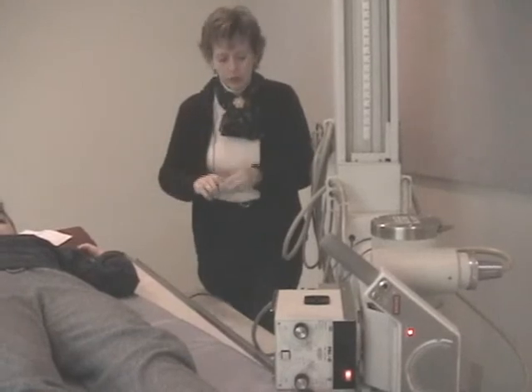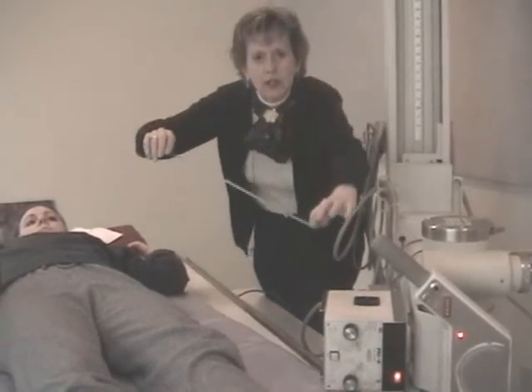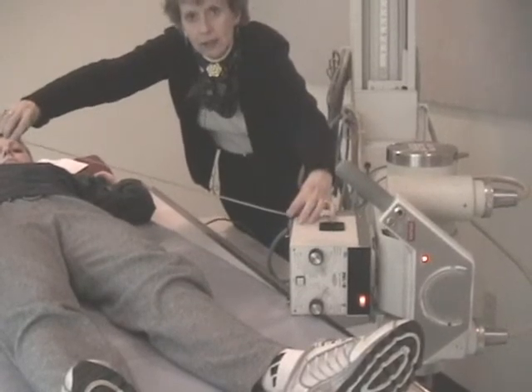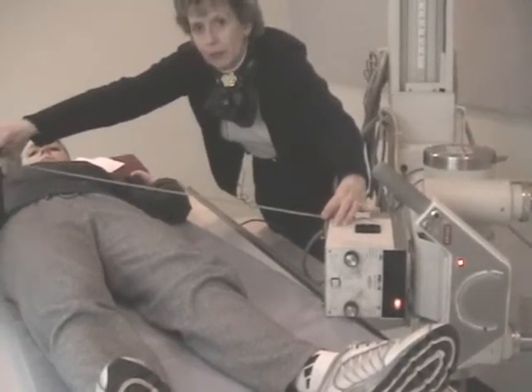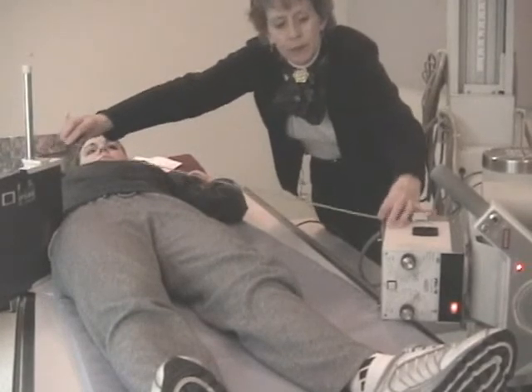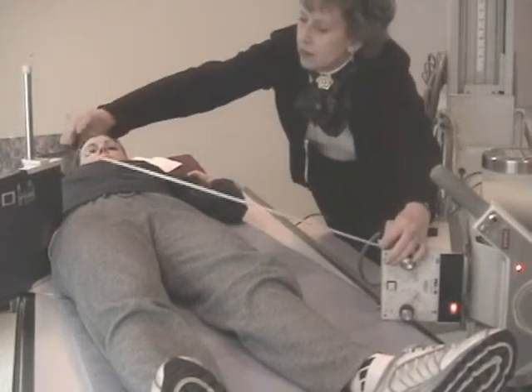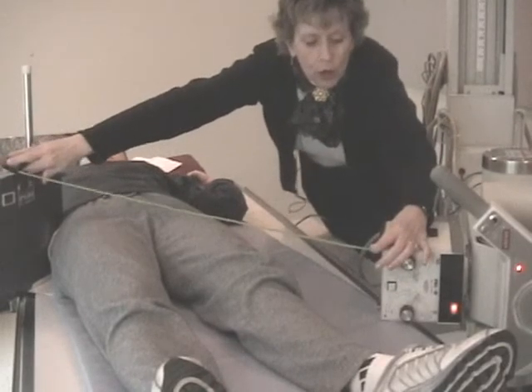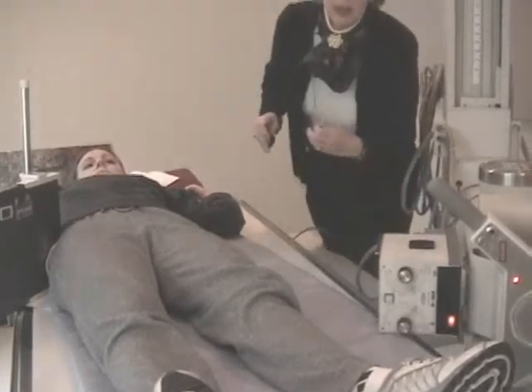Use your tape measure. We can focus down on the collimator, and you take one side and measure it to the film. Okay, that measures 31. Go away a ways, and that should measure 31. Then you know that the relationship is parallel.